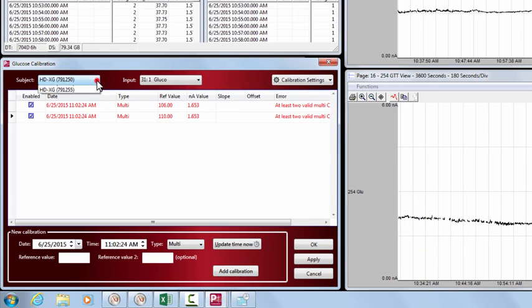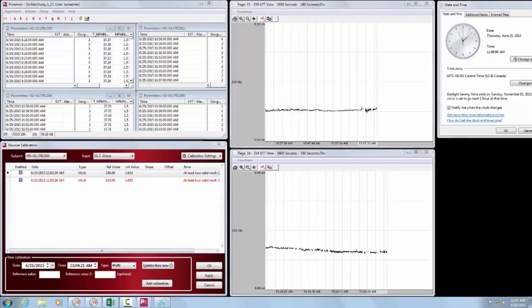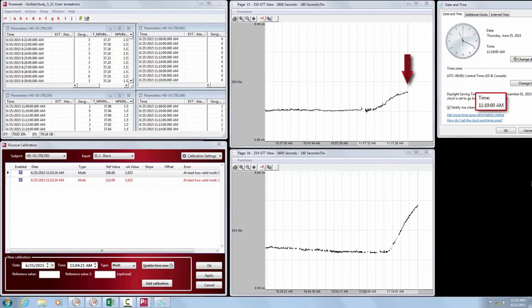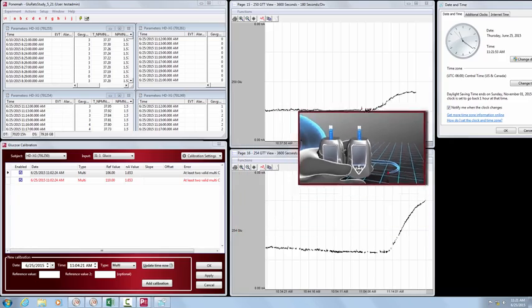Repeat the collection of baseline values and dosing for the remaining animals while also observing previously dosed animals for peak glucose levels. We have compressed the time it takes for animal 1 to reach peak blood glucose levels. Once a glucose peak is detected, note the time and wait an additional 3 minutes. Then, take the second set of blood glucose values with the glucometer.